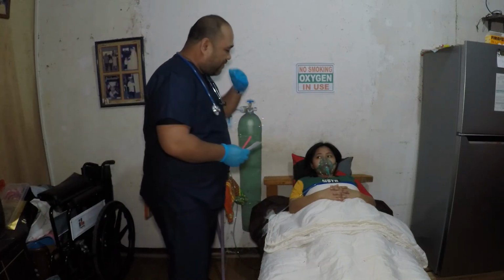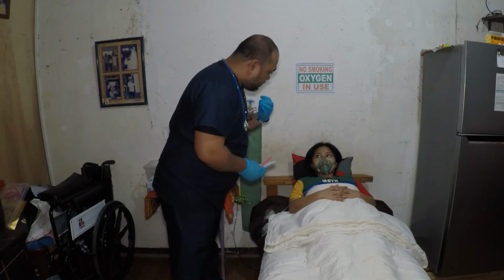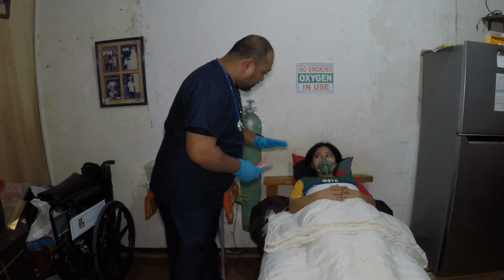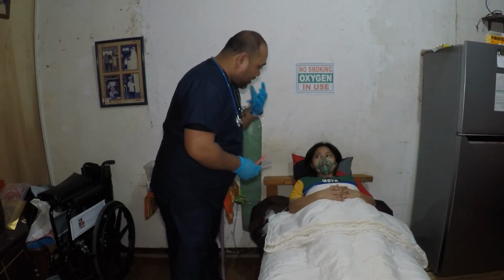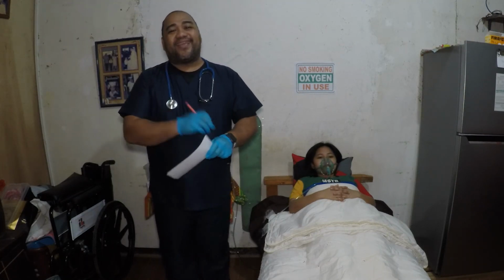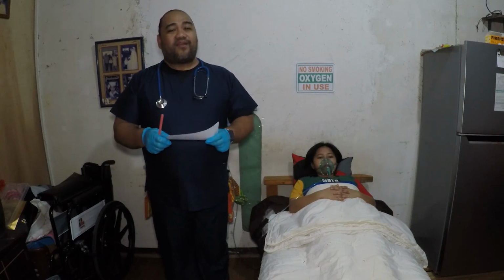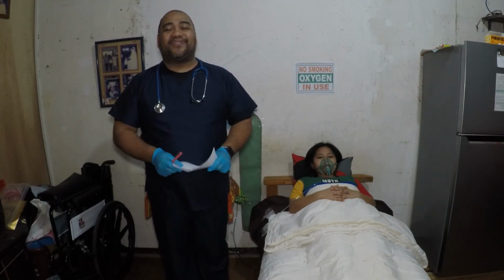So ma'am, if you need something, or you cannot breathe properly, or something is not comfortable, just call us, okay? So if you're not really comfortable with the face mask, okay? Alright. Then make sure also to clean the nasal cannula after use by soaking in soapy water for an hour. Dry it properly. Clean the tip of the cannula with a spirit swab before applying to the client.